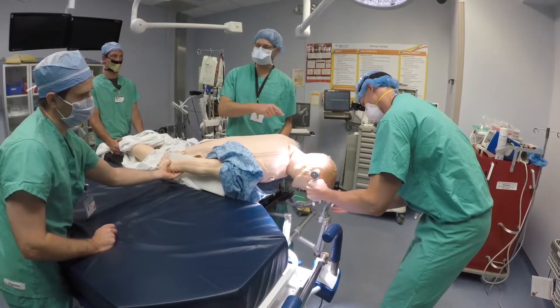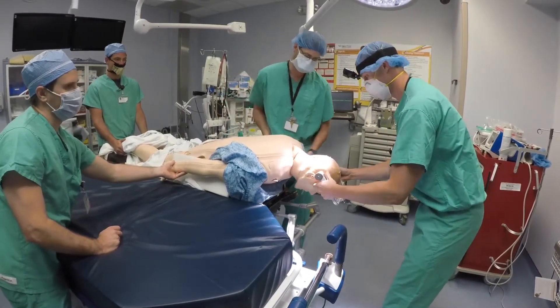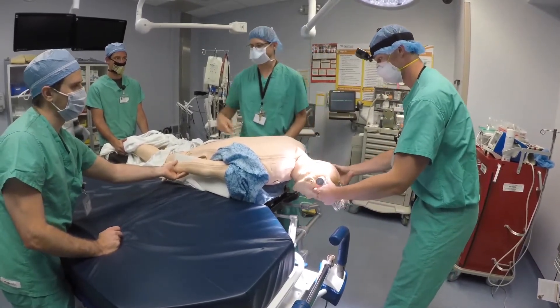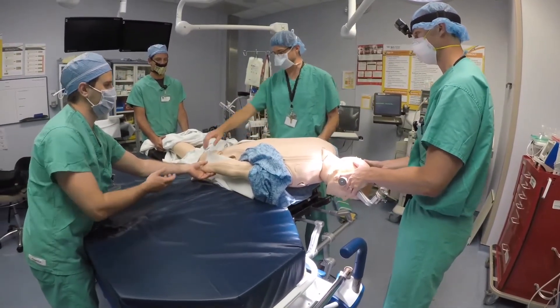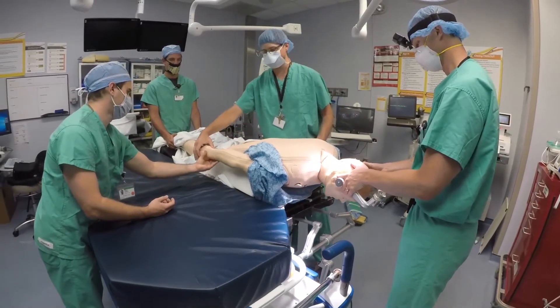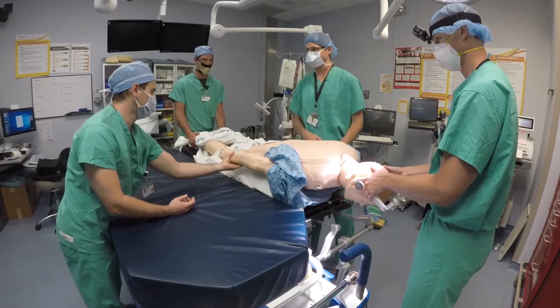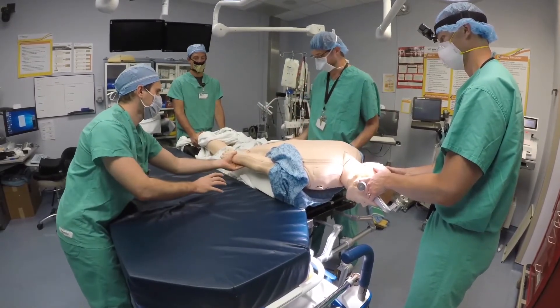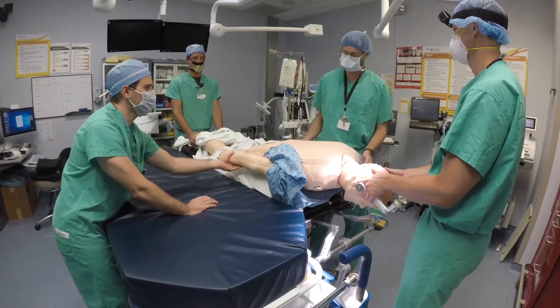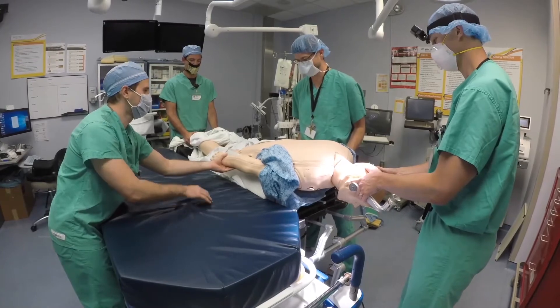He's going to hold the head and control the pens, anesthesia will be there to monitor the airway, and then your main role if you're on that side is just to catch the patient and control the arms. You want to make sure — as we discussed, military position — that they don't get twisted or anything like that; you can dislocate somebody's arm or shoulder. If you're on this side you're going to push. Everybody ready? One, two, three.